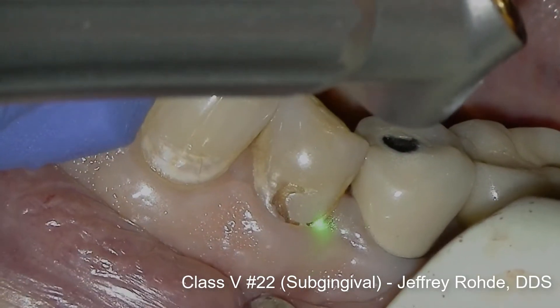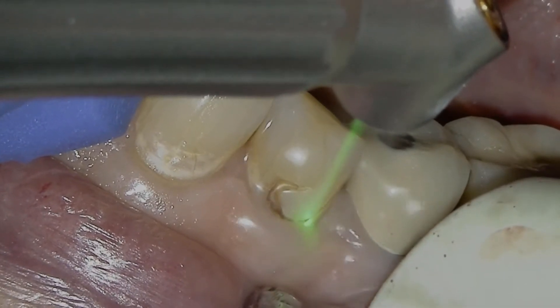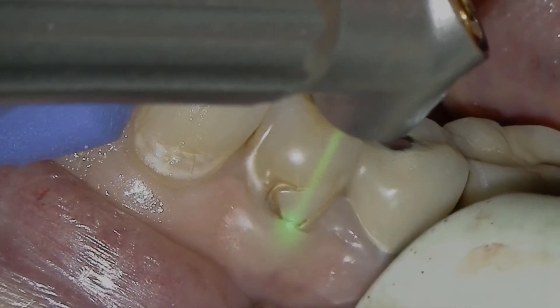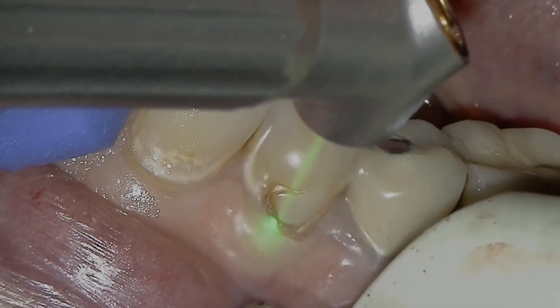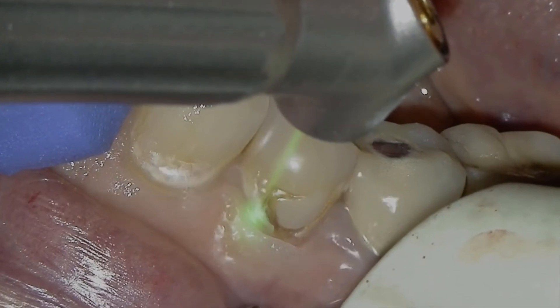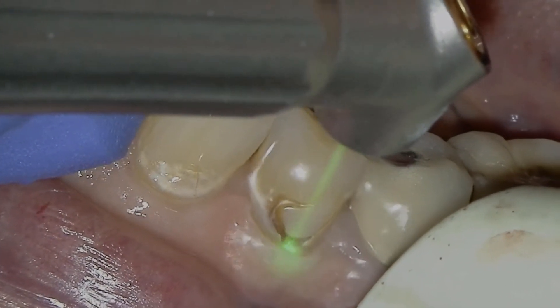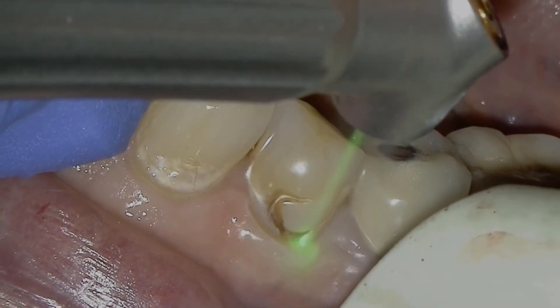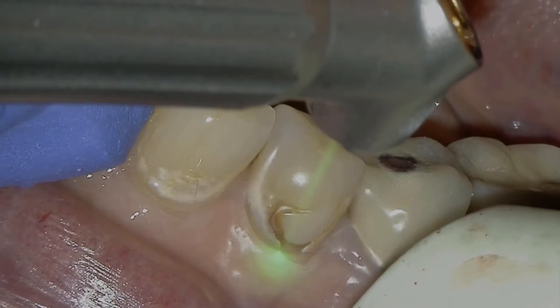This subgingival Class 5 on tooth number 22, which was completed anesthesia-free and blood-free, is a great example of how Solea simplifies dentistry. First, a gingivectomy was performed using Solea. Then, without stopping and by simply changing pressure on the foot pedal, Solea was used to remove both the old composite filling and enamel. The patient reported no post-operative pain and incredibly fast tissue healing was observed.